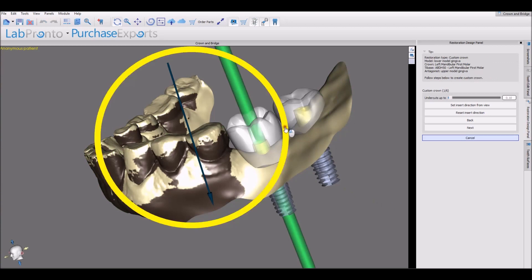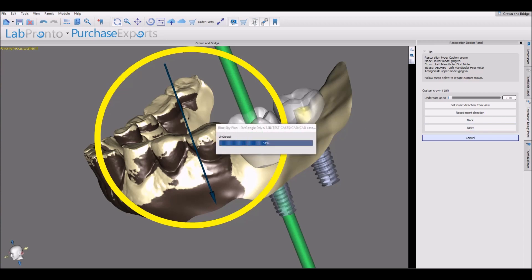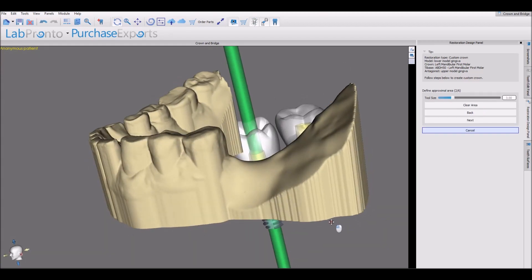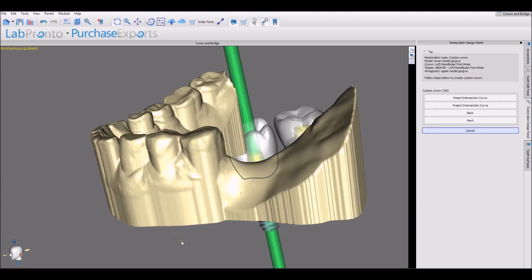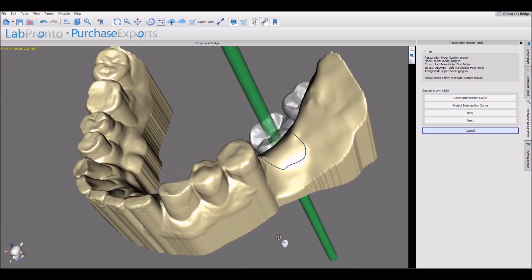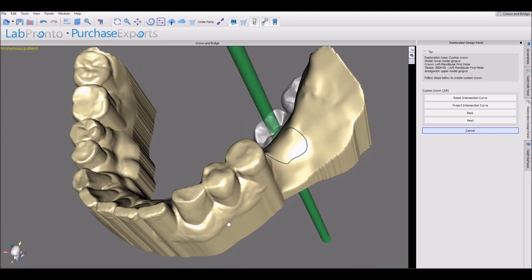The first thing we're going to do is set our path of insertion, then click Next. We're going to define the proximal area — hold down the Shift key and grab and drag with your left mouse button, then click Next. Here we have a curve based on our intersection of the crown and the model. We can make any modifications by holding down the Shift key and grabbing and dragging with our left mouse button. Once we have the desired curve, click Next.